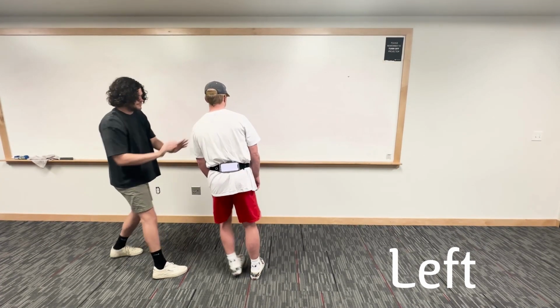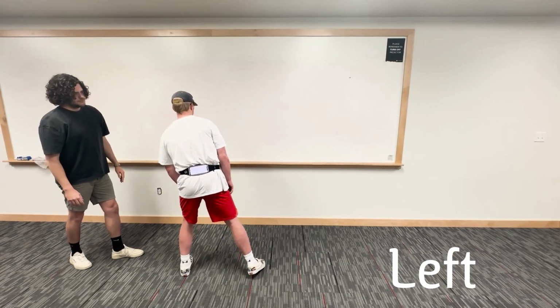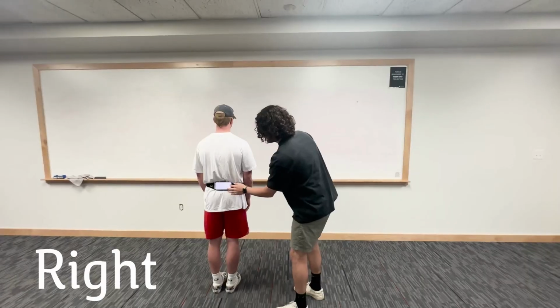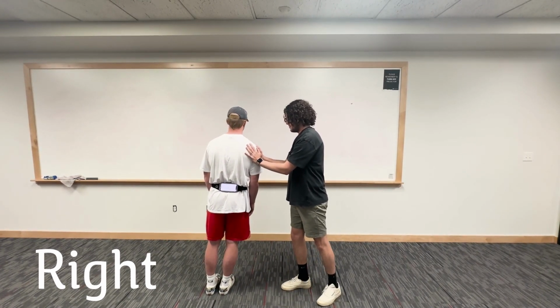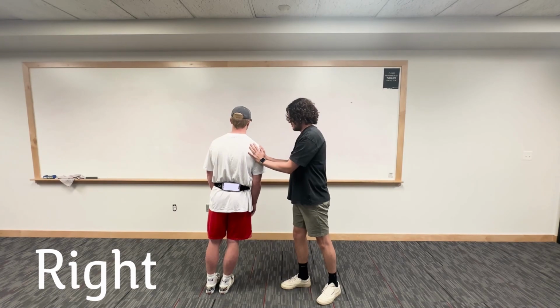Now, for someone who is not concussed, it will look easy, like this. For someone who does have a concussion, though, they will likely stumble over themselves, and it will take a little bit longer for them to regain their balance.